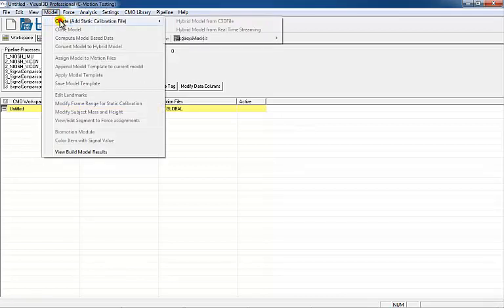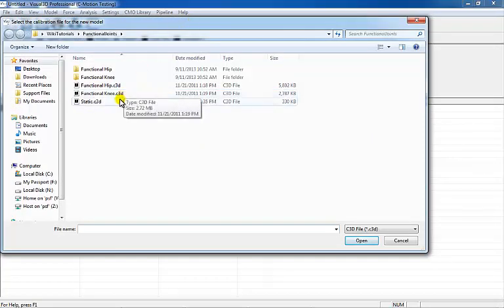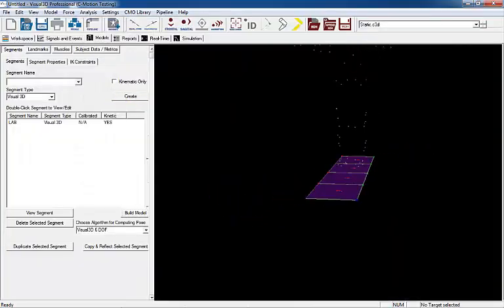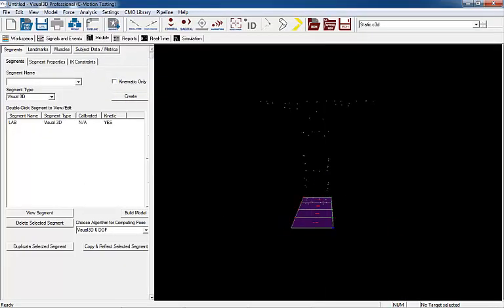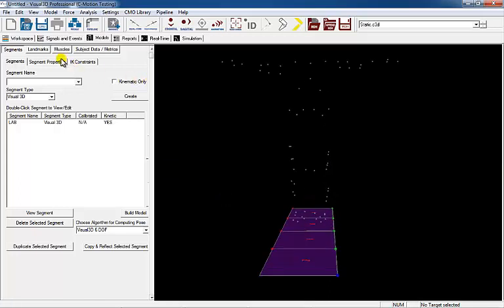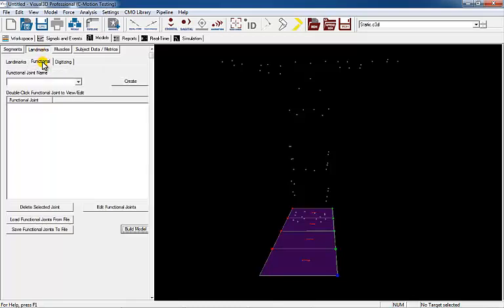Begin by loading a hybrid static file into the workspace. Once the file has been loaded into the workspace, select the Landmarks button and the Functional Joint tab.